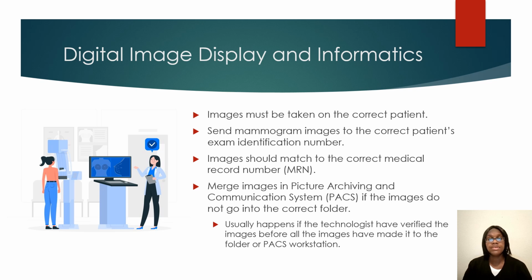Now, whenever the images are being sent over, before you even send anything or take any images, make sure that you have the correct patient, the correct date of birth, and the correct exam. Because if you accidentally take images under the wrong patient, number one, it's going to be hard to find those images, and number two, the wrong patient is going to get the results, or the right patient is not getting the correct results.